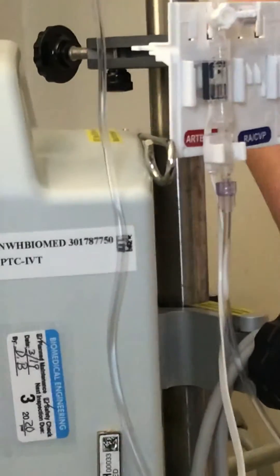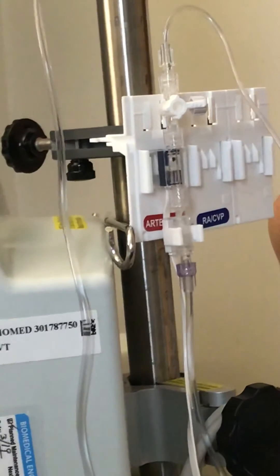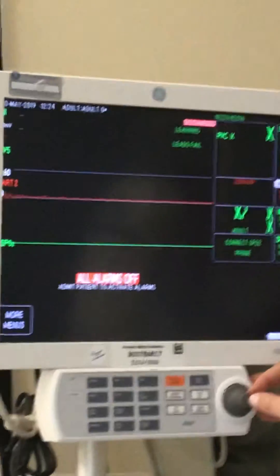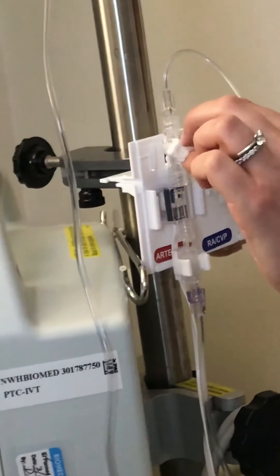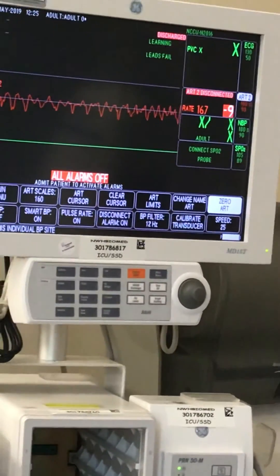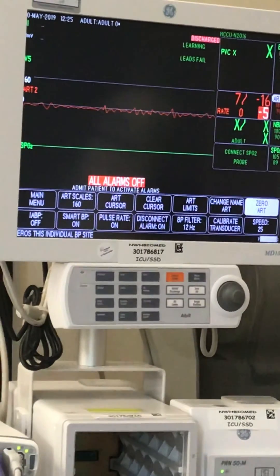Level to the phlebostatic axis first: mid-axillary line, in between the fourth and fifth intercostal space. Once leveled — adjusting up or down based on patient position — go to the monitor, click on arterial pressure, and scroll to where it says 'Zero Art.' Turn the transducer to the off position to the patient, click zero, and you should see zeros on the screen. Perform a fast flush, then turn back to off to atmospheric air. You should then see a waveform and get a systolic, diastolic, and MAP reading. The same steps apply for central venous pressure monitoring.